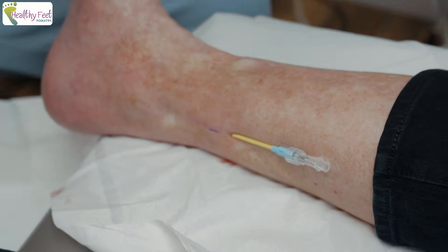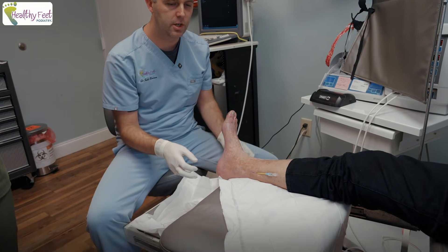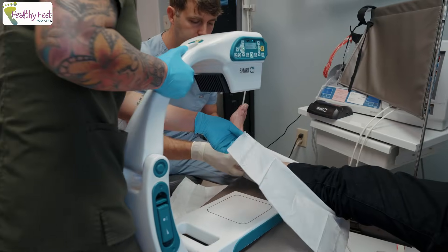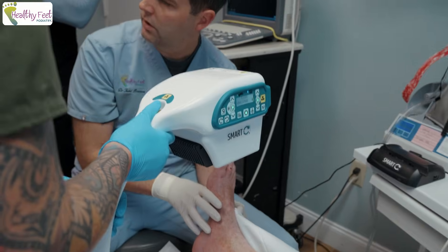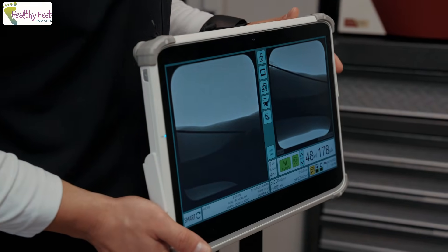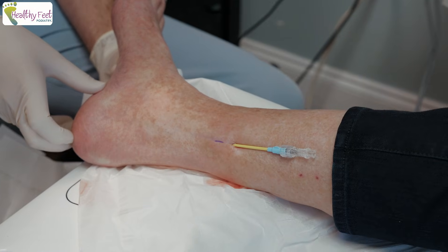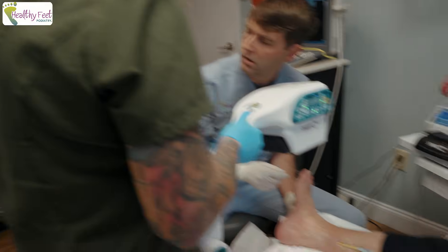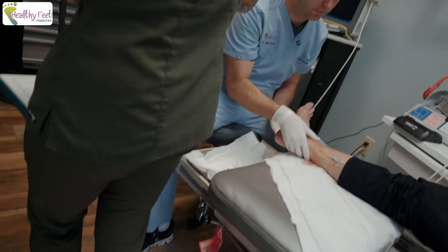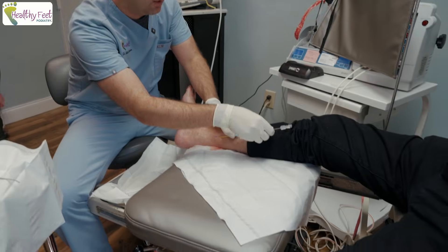Let me get that X-ray up please. Are you able to hang your left leg off to the side — are you comfortable doing that? Lift up, slide down this way a little bit. I'm going to rotate your leg a little bit this way if possible. Now I'm just going to slide out the sharp part of this, which helps me guide the introducer.